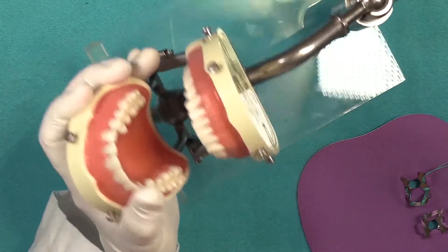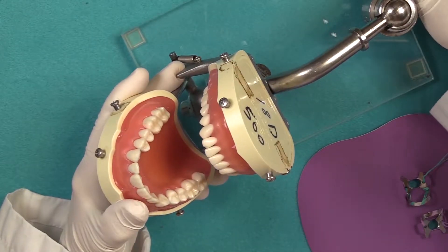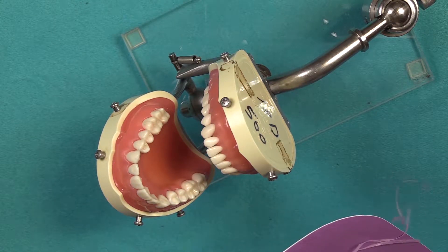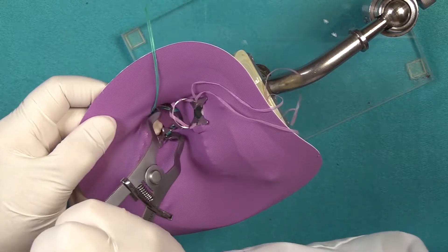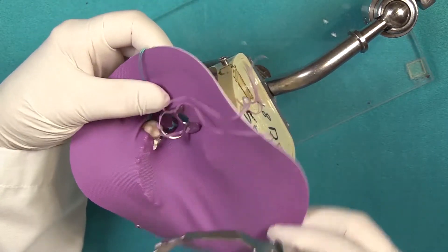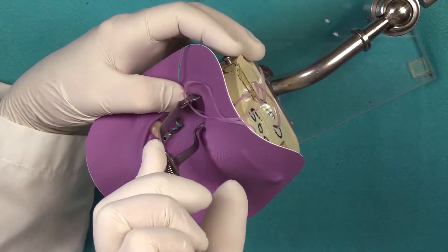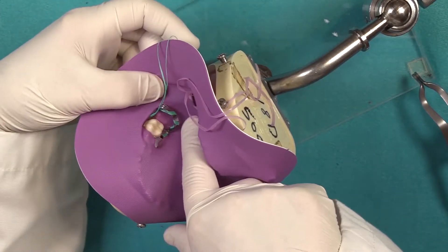Our patient today is going to have a Class 1 done on both first permanent molars, upper and lower arch on the left-hand side. When doing this procedure, it's recommended to place the clamp on the upper arch first. Once that is done, you place the clamp on the lower arch. This is the reason why you need to make sure there's extra room.